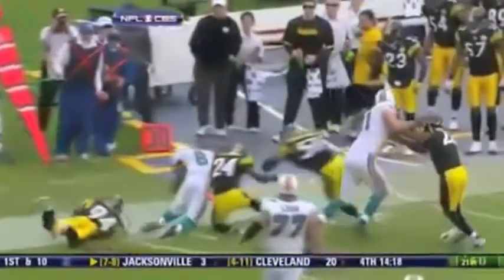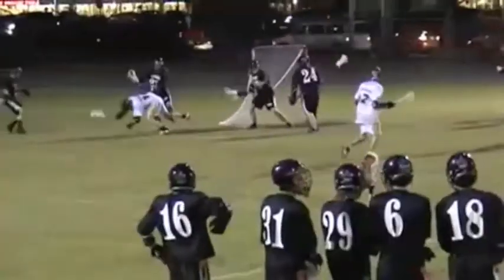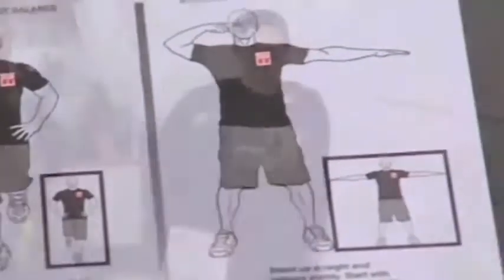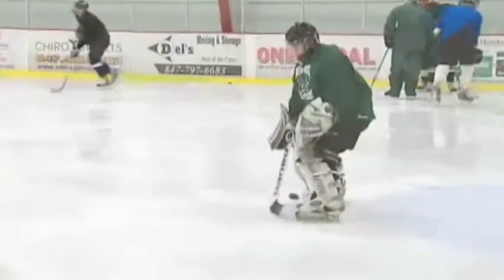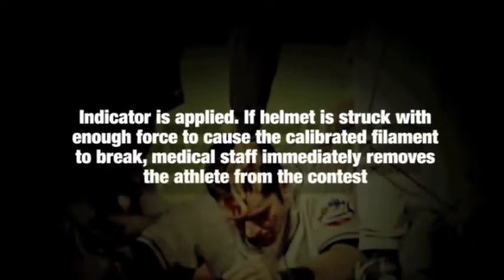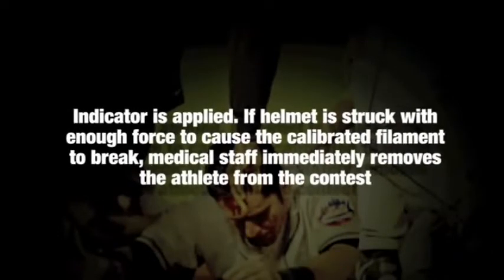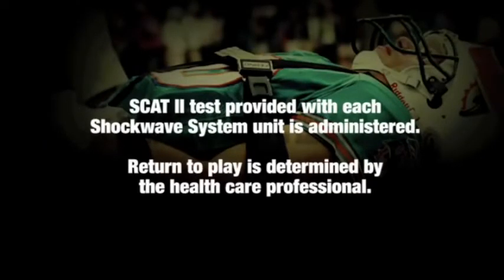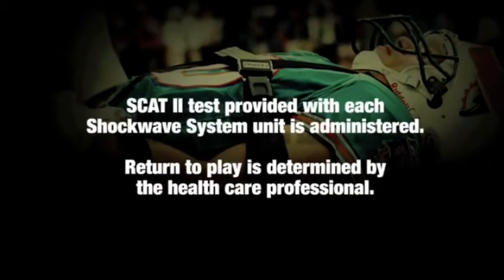One of the first items that happens when someone has a brainstem injury is they lose their balance. And so Tim came up with a baseline test where they go through a series of yoga poses, and based on that you can determine whether a person has had an injury. Based on the tilt mechanism inside of these gyros and accelerometers, we can determine whether or not a person has deviated from their baseline test, whether they've been in a position of recurring brain injuries, and whether or not they're well enough to participate.